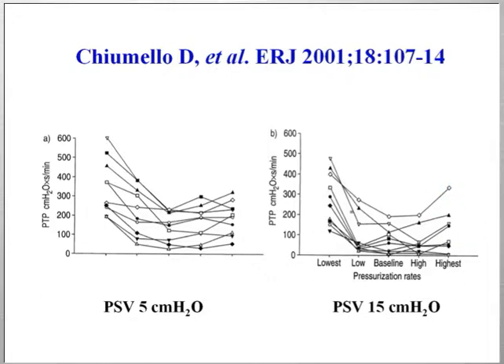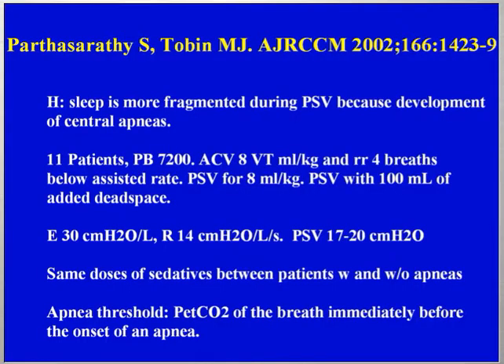And also this particular shape of the inspiratory muscle effort was nearly the mirror image of the dyspnea sensation in these patients. So the patients felt very dyspneic when they were ventilated with this low pressurization rate, and also felt dyspneic and uncomfortable when the pressurization rates were maximal.